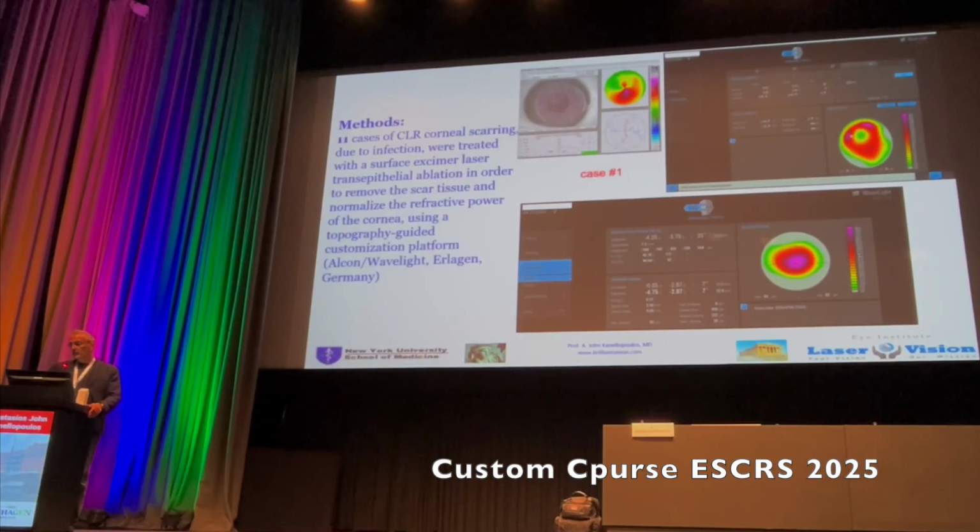It's quite complicated with topography guided because you have to find out how much myopia this will induce. When you use topography guided treatments, the device aims just to normalize the cornea. The topo guided treatment does not have the intelligence to also predict how much myopia this treatment will induce. We all agree that if we treat this on cornea, this will make the cornea steeper in the central and will induce myopia. It looks like a little bit of a decentral hyperopic correction.